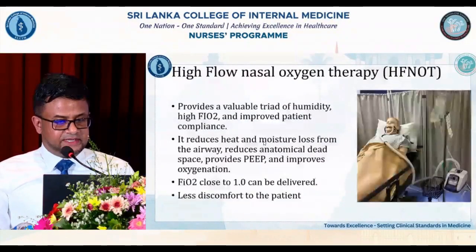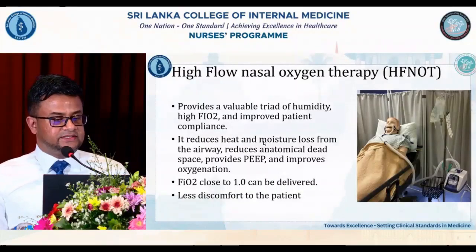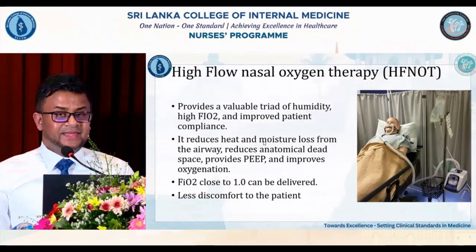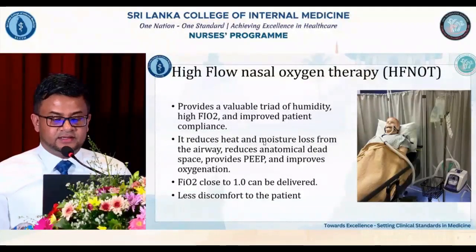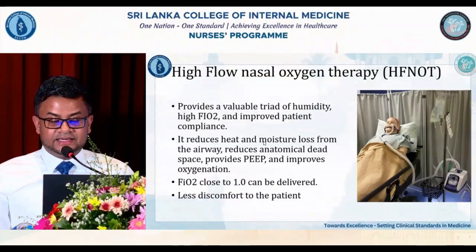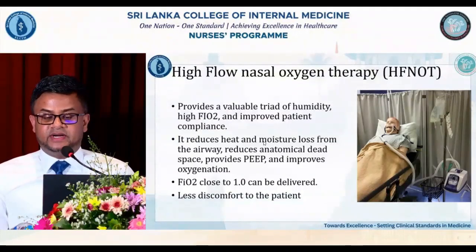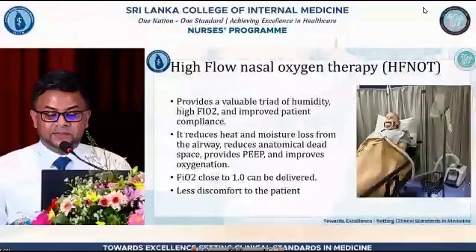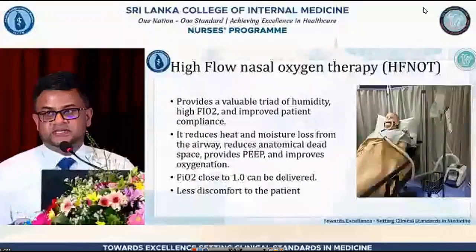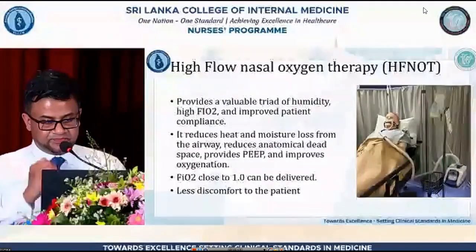Right. A little bit on high flow oxygen therapy, because in the COVID era we have been using this abundantly. High flow nasal cannula are increasingly used as an alternative device for adults and children, including infants and neonates, requiring medium to high concentration of oxygen therapy.